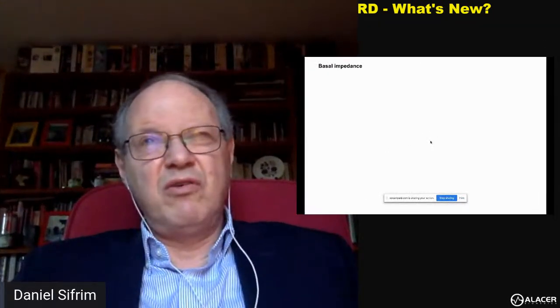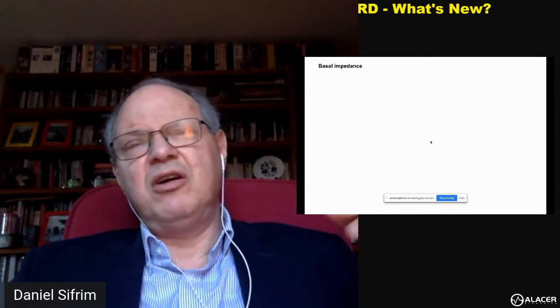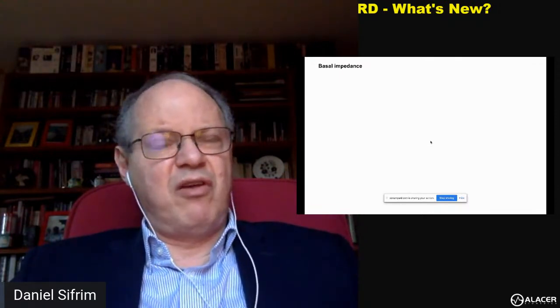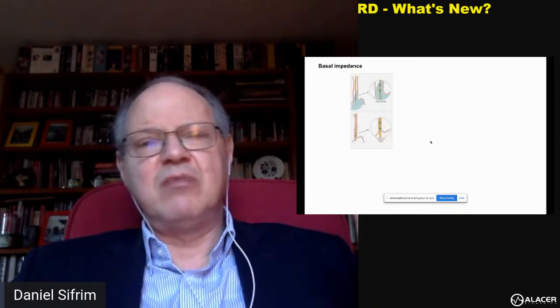Now, I mentioned that there are patients in which you don't have a conclusive diagnosis of reflux disease based on endoscopy and pH metry. For example, they have an acid exposure of 5%, or they have around 50 reflux episodes, and the endoscopy shows an esophagitis grade A, and the symptoms are not particularly typical. So you want to know if the mucosa of the esophagus is healthy, is very healthy, or it is somehow touched by reflux. And impedance can give us a hint on the status of the esophageal mucosa.